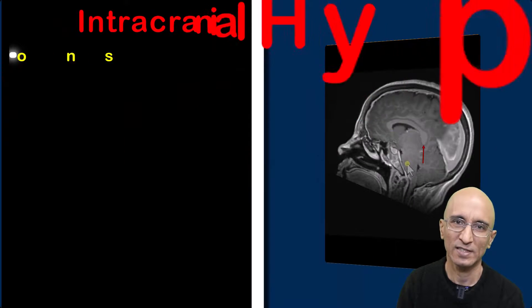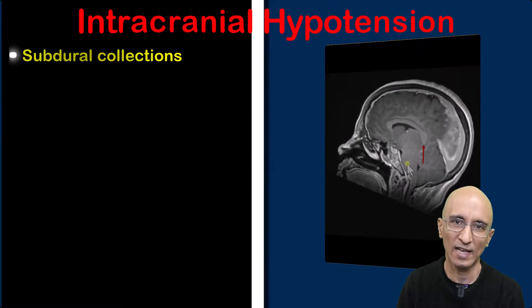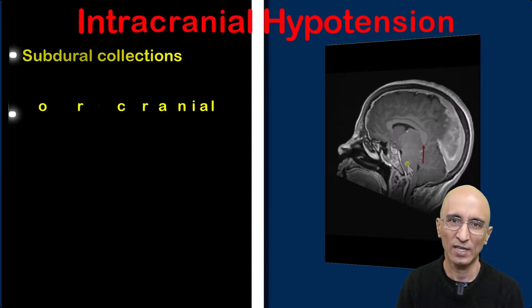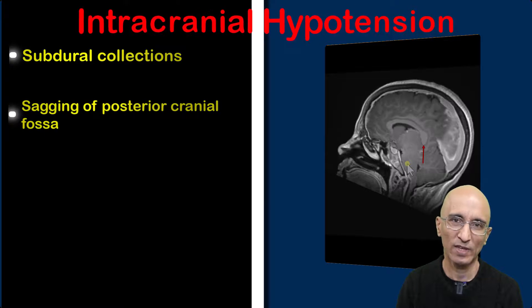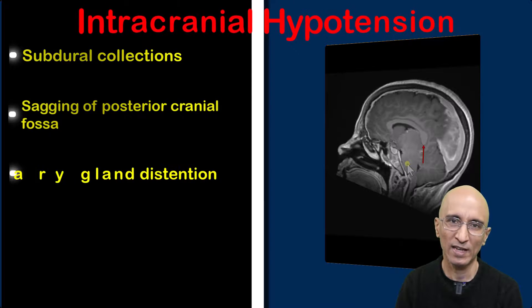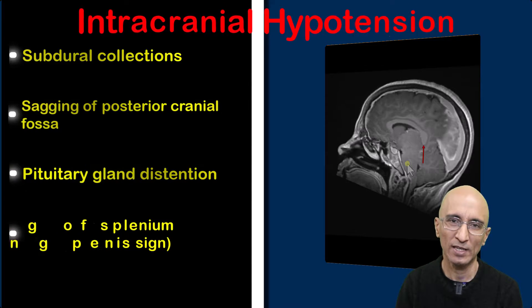This constellation of findings is consistent with intracranial hypotension, as evidenced by bilateral subdural collections, sagging of the posterior cranial fossa with narrowing of the distance between the mammillary body and pons, narrowing of the angle between the pons and the midbrain, narrowing of the interpeduncular angle, distension of the pituitary gland, and drooping of the splenium of the corpus callosum.